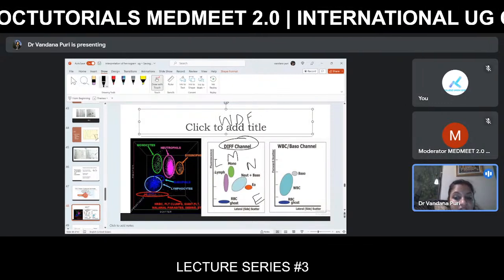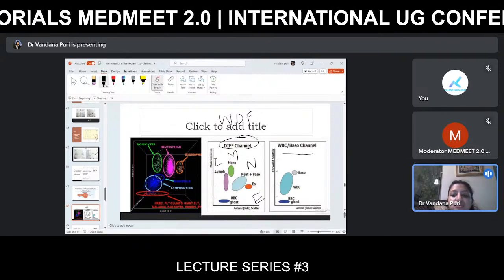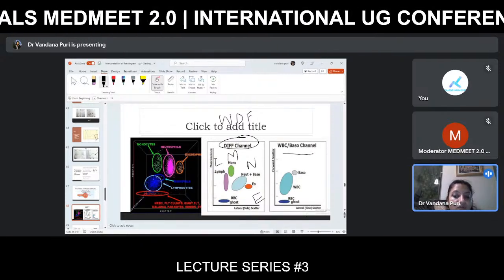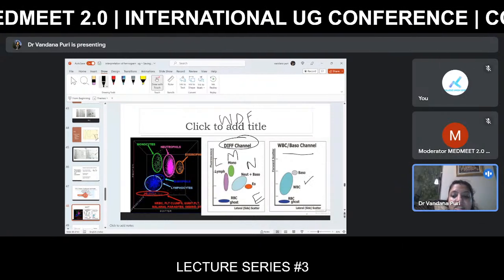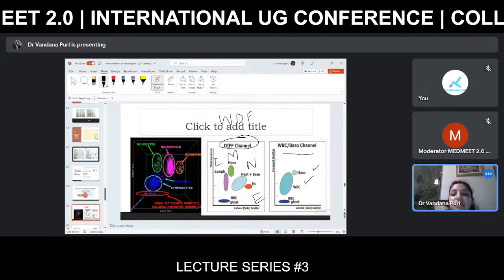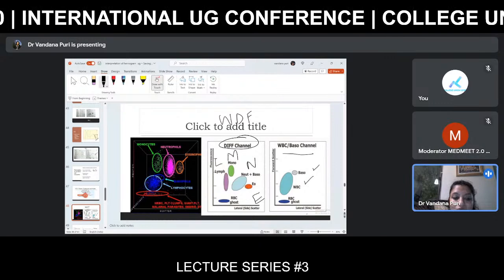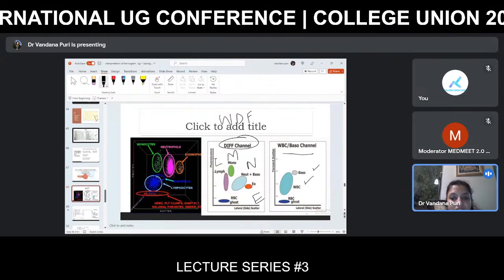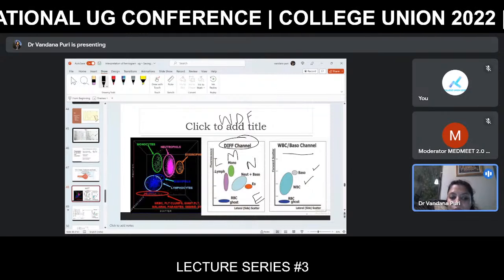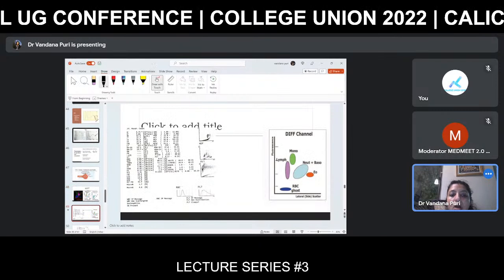We have another channel called the WBC baso channel, in which we have side scatter and forward scatter. Basically in this channel, we differentiate WBCs and basophils. Apart from that, there is another channel called the WNR channel, which I'll show you later. But let's look at the image before going to anything.